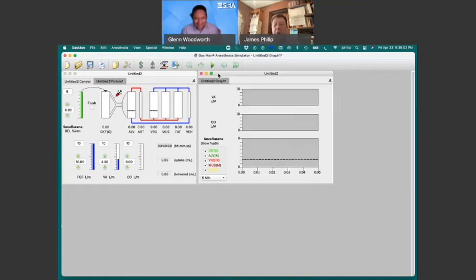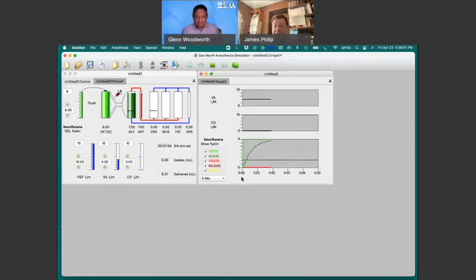But what we want to see is that the initial rise of the alveolar partial pressure of anesthetic is an exponential curve. And that exponential curve has a time constant equal to the volume of the patient's lungs divided by the ventilation into the lungs. Right. So you're explaining the washin, essentially just to the lungs with no effect on uptake from the cardiovascular system. Exactly.